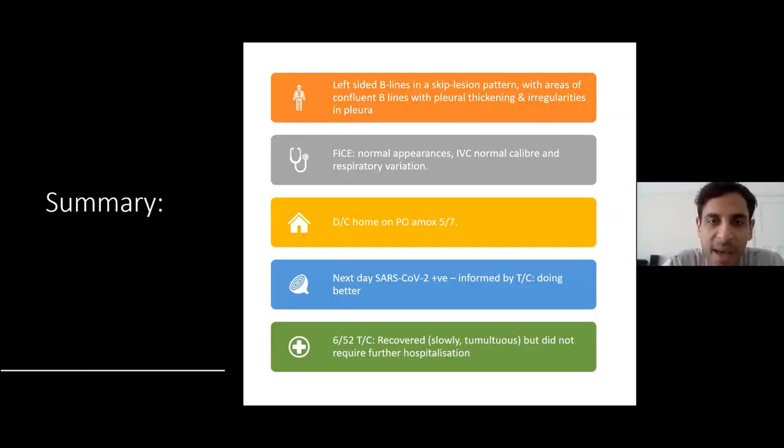In summary: typical history and presentation of suspected COVID from the beginning, but with a completely normal X-ray. On ultrasound, very convincing appearances of COVID — left-sided B-lines in a skip lesion pattern with areas of confluent B-lines, thick and irregular pleura, and sub-pleural consolidation developing. His heart scan was normal and he wasn't fluid overloaded. We safety-netted him, discharged him home, swabbed him. The next day he came back positive. He had a rocky clinical course over six weeks but didn't require readmission and improved.